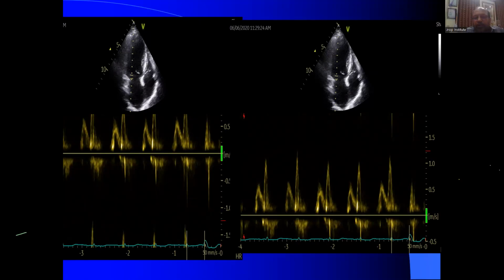Sir, may I add a little bit to this? If you have a person whose normal velocity is up to 1.7 meters per second, keep your Doppler scale close to 2 meters per second. Look at this Doppler scale seen on the right side of the screen, 1.5 and 0.5, so it's almost a 2 meter Doppler scale. If the forward maximum flow velocity is 1.3, that is mitral, and the downward flow is 1.7 of aortic, keep this scale around 1 meter on this side and 1 meter on this side, and that will really help you out.